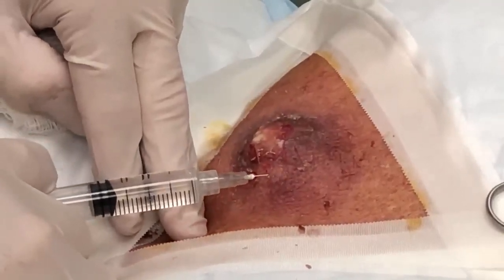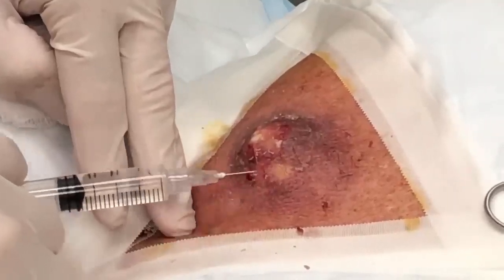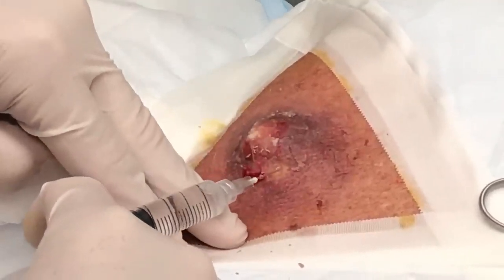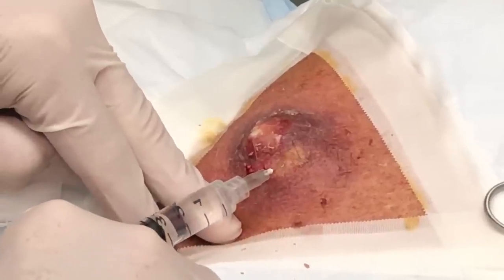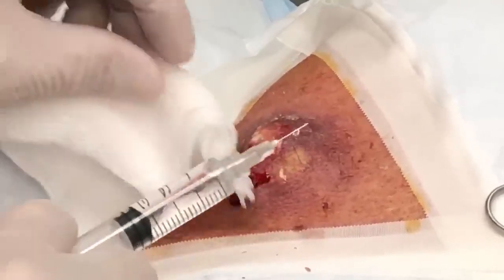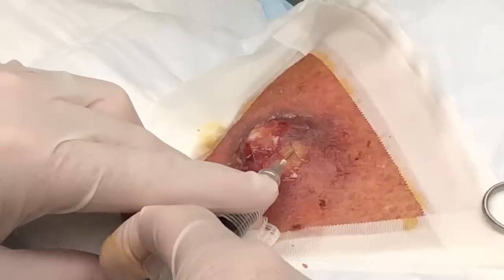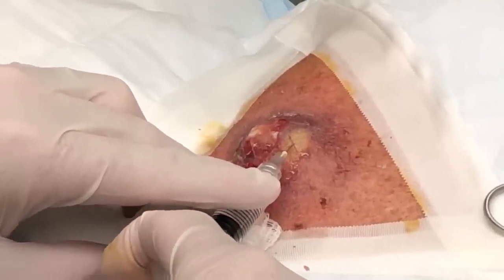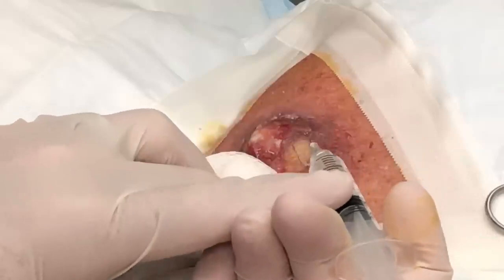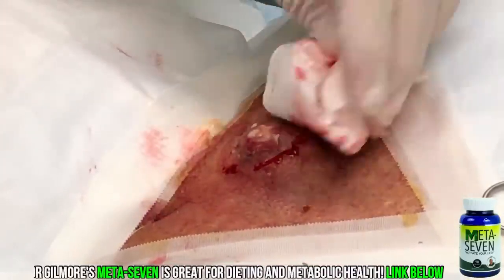So we're going to do another needle after this one, okay? All right, so we're going to go shallow first, and then we'll go deeper. So we know that there's an underside to this, right? There's a bottom, and underneath that is going to be some myofascial kind of material, muscular tissue, along with some connective tissue, right? And so when we start scraping down there, that's going to hurt if we don't get an anesthetic in you. All right, now we're going to go a little bit deeper.